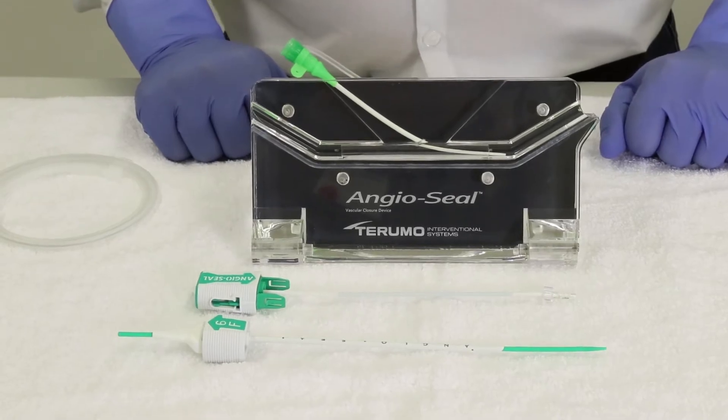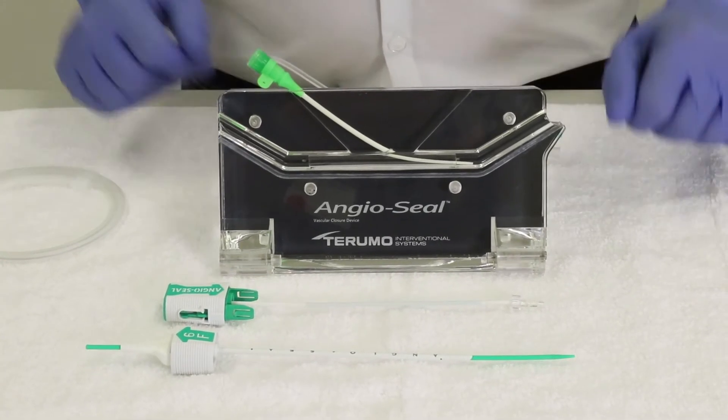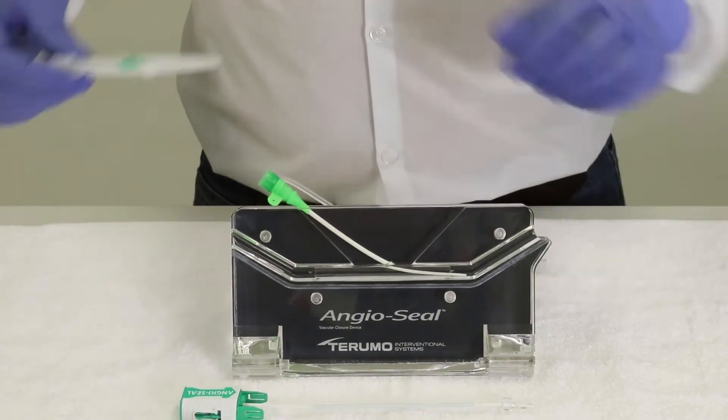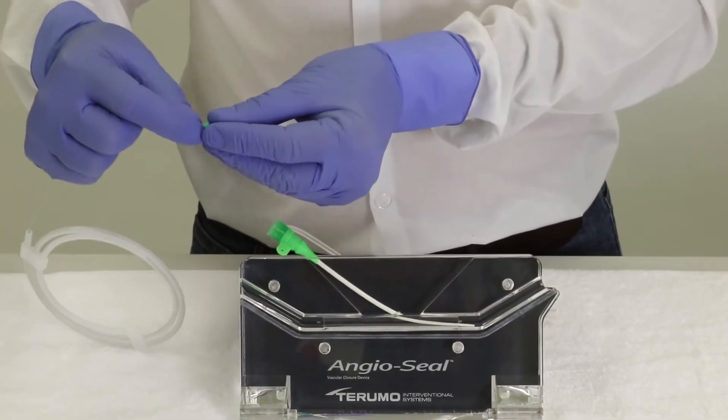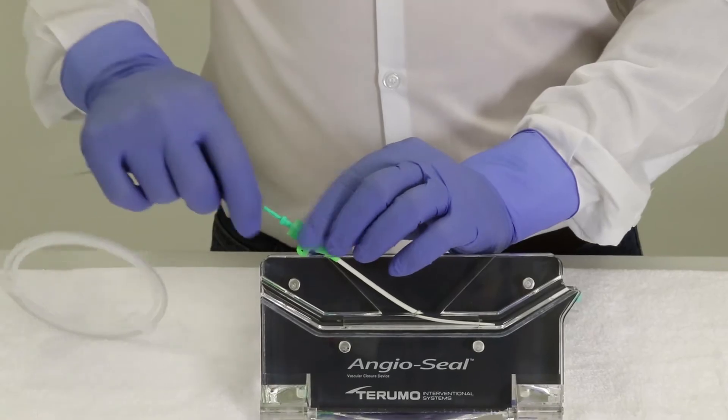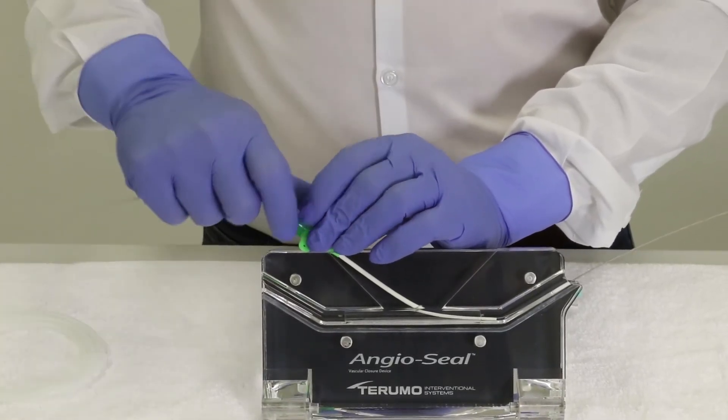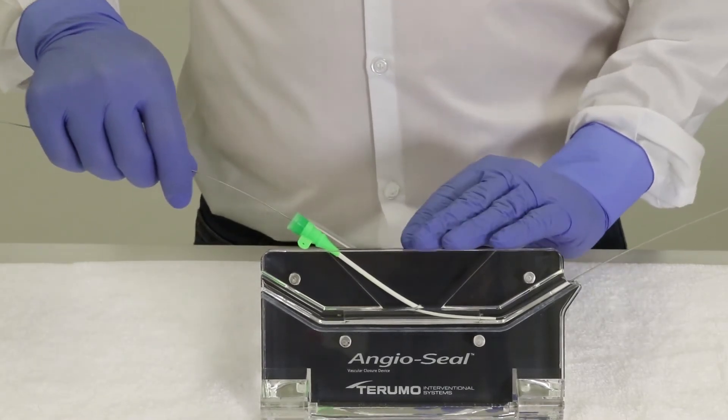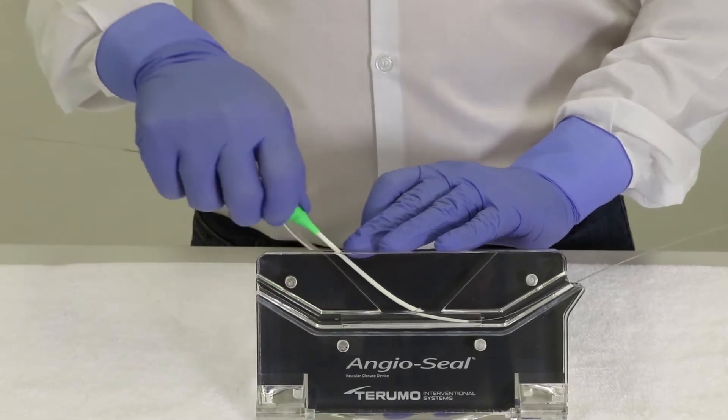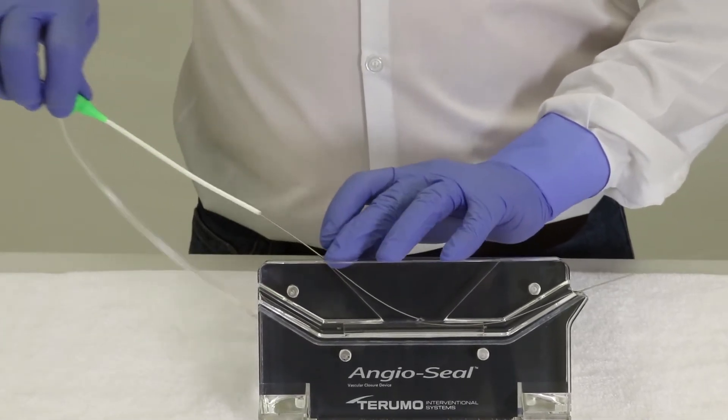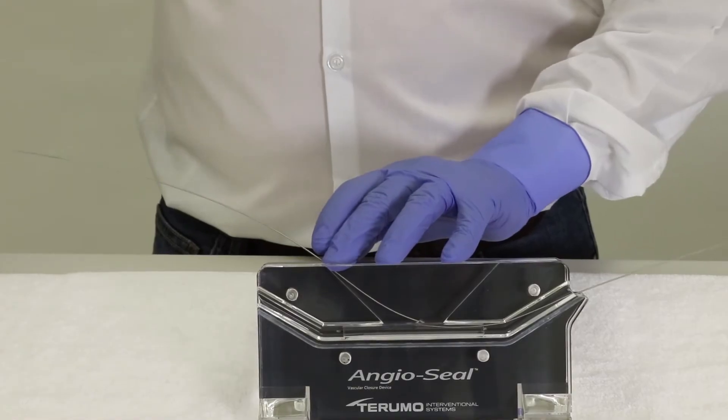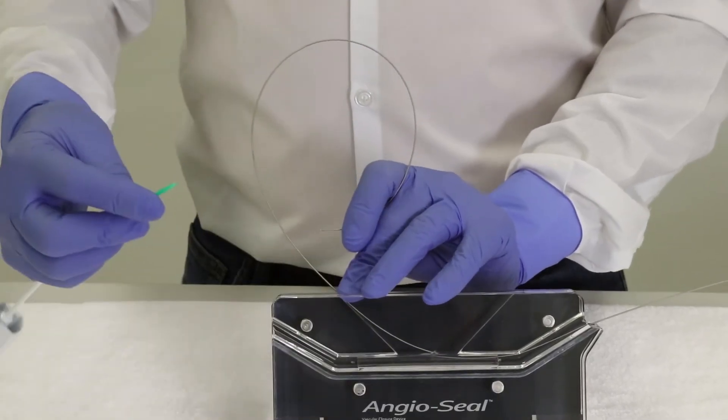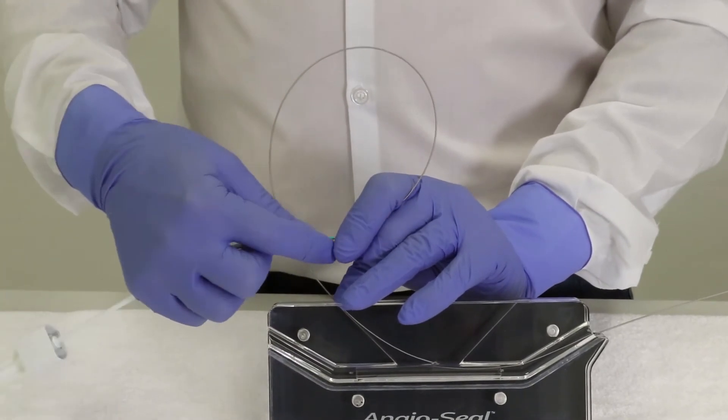Now let's start. The patient's head is on my left and the femoral access is on the right. Insert the guide wire for the sheath exchange. Position your fingers to hold pressure as the sheath comes out to maintain the wire position. Now coil the wire once and hold with your thumb and forefinger. Grab the sheath and dilator by the tip and load these two together.